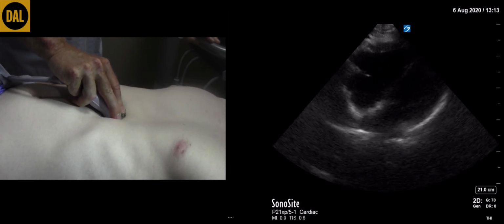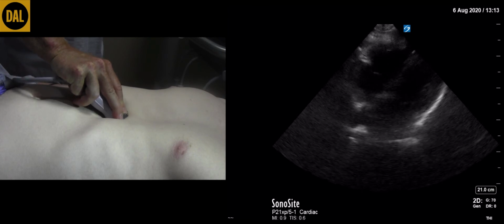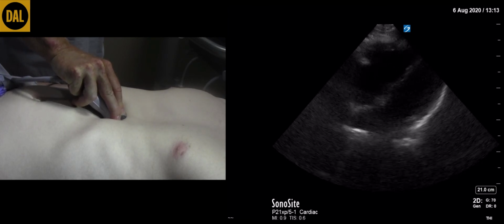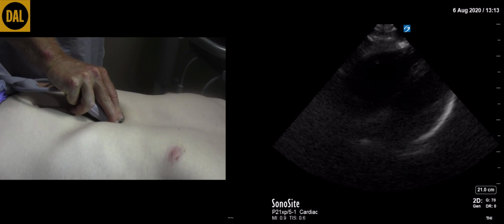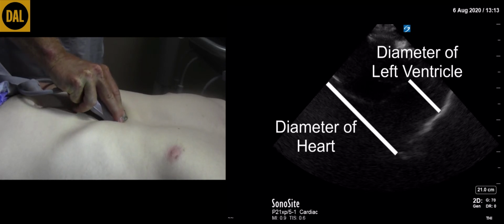Consider the 3 F's: form, function, and fluid. Assess the overall size and shape of the heart. Consider the relative size of the right and left ventricles. The left ventricle should take up 2/3 the diameter of the overall heart.